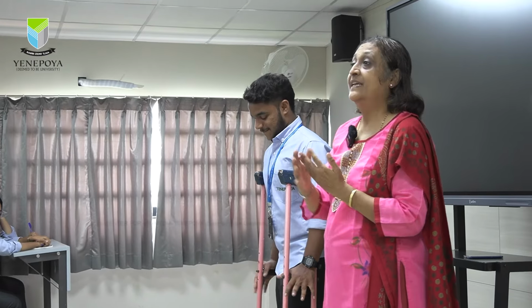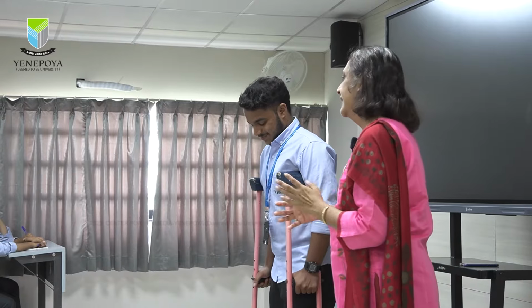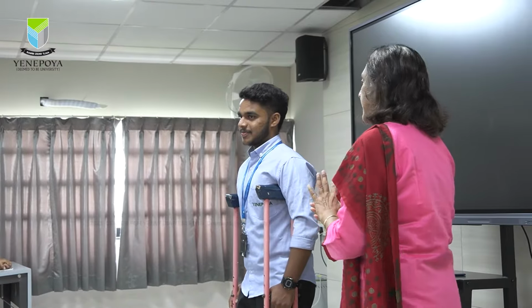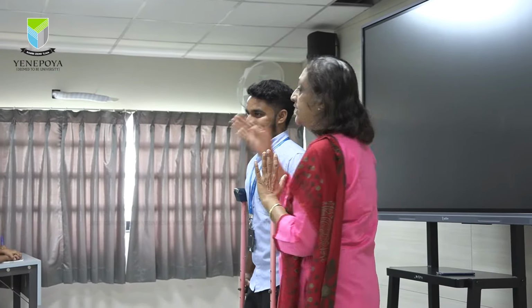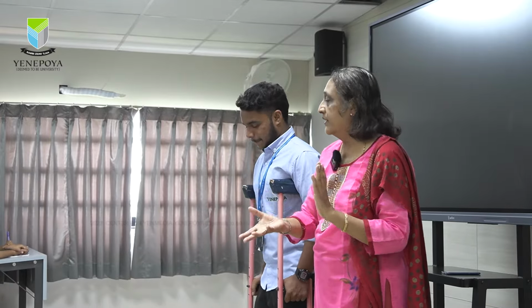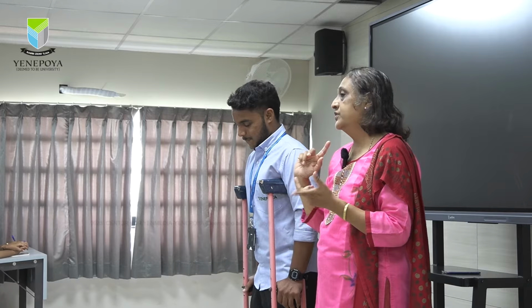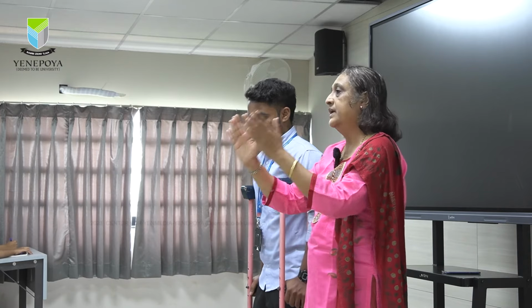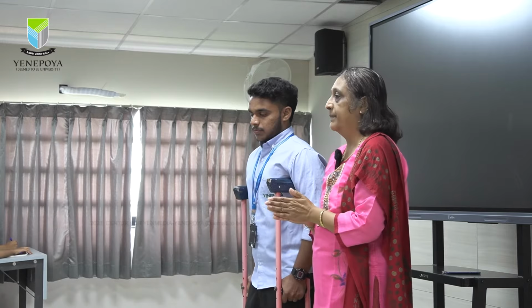Whatever pattern the person adopts, it is better if it is comfortable for him. But always check that you go with the normal walking pattern, that means the shoulder girdle and pelvic girdle movements, the opposite movements, are carrying forward together. That means he will be within the normal walking pattern.